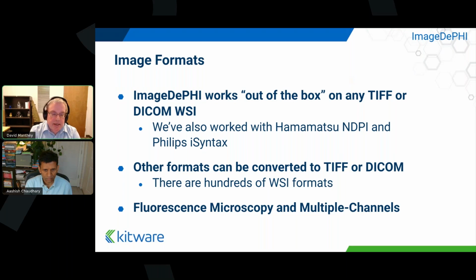Philips iSyntax requires that you have things licensed in order to be able to work with those files. And if you end up with other formats besides TIFF and DICOM, there are literally hundreds of formats. We've integrated with OpenSlide readers, a variety of readers, so we can read a lot of different formats. We have our own libraries for doing this. If there's a format that isn't TIFF or DICOM, we can convert it to TIFF or DICOM.